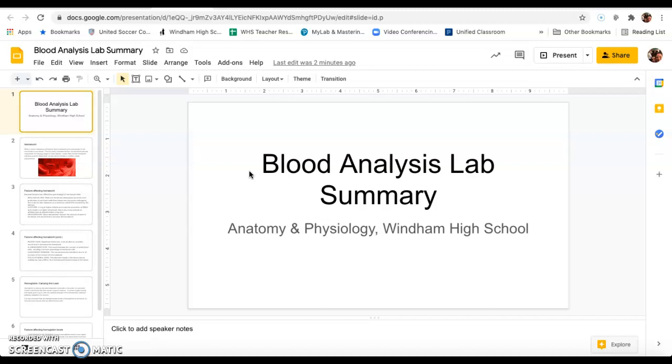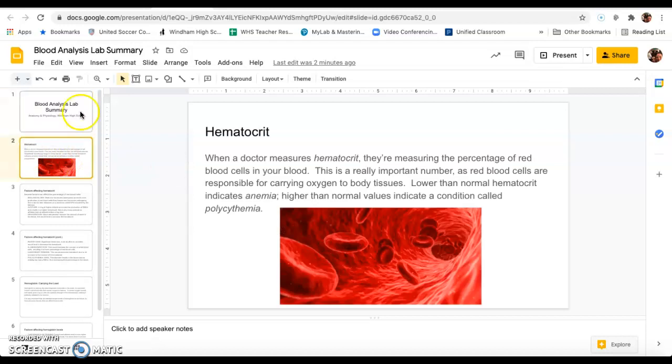These blood analysis tests that I had you walk through in the simulation, primarily the really important take-home messages had to deal with the abundance of red blood cells and the hemoglobin that those red blood cells tend to carry. So let's jump right into it.